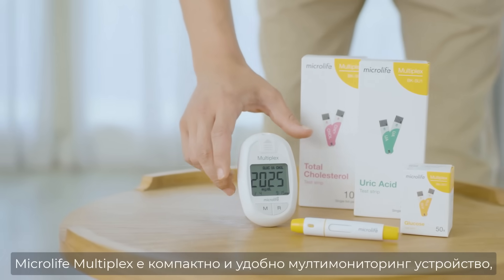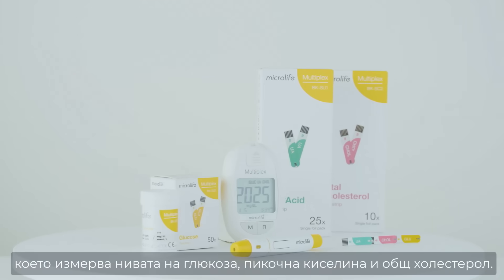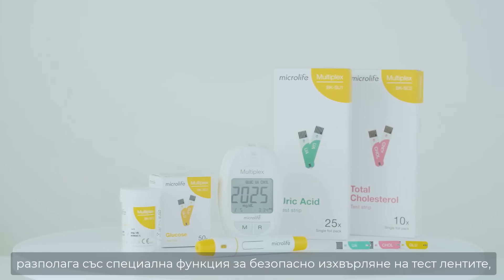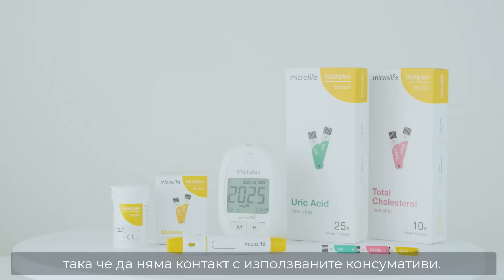The MicroLife Multiplex is a compact, easy-to-use health monitor that tests glucose, uric acid and total cholesterol levels. It requires only a tiny blood sample and features a strip ejector for safe, touch-free removal of used strips.